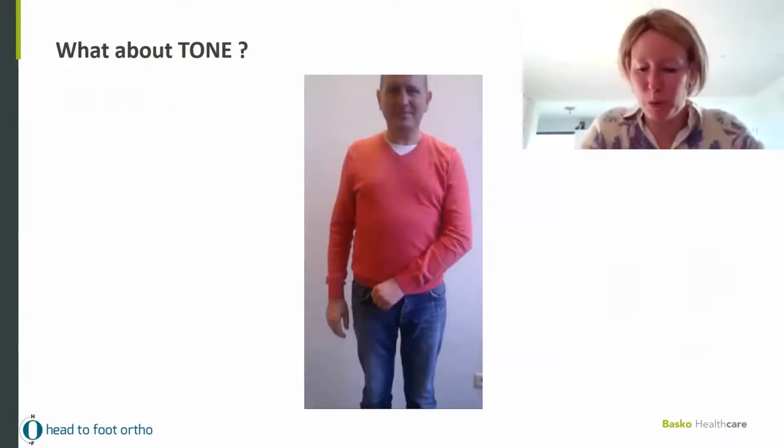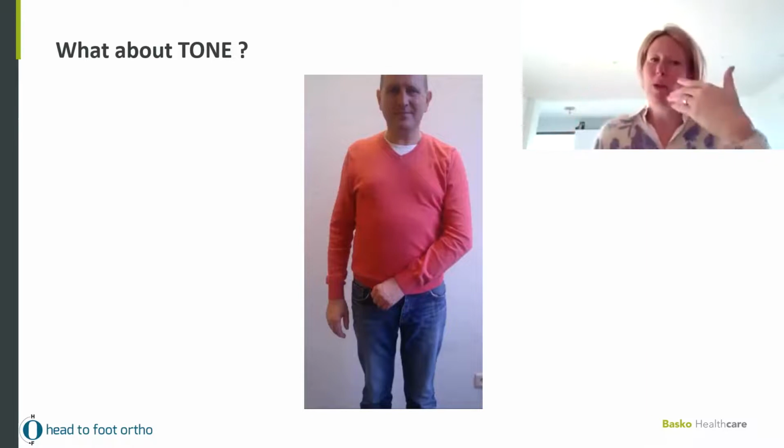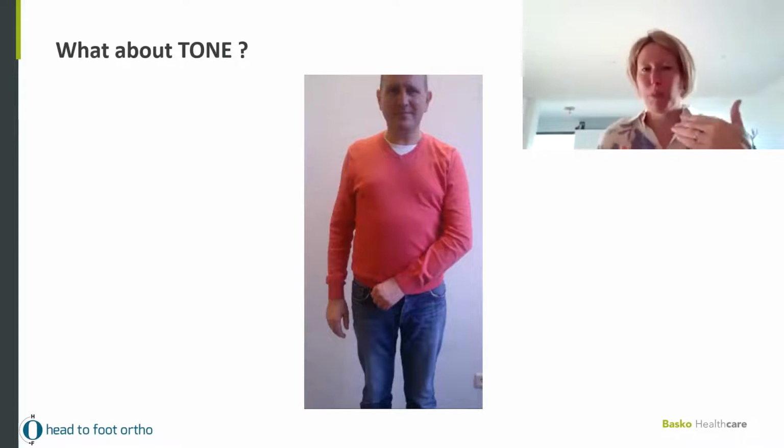Talking about tone, what can we do with tone? We do have another way of managing tone. This is just by searching the right force to have that relaxation on tone. And then you don't have to increase. You can increase if needed, but it's not the purpose.